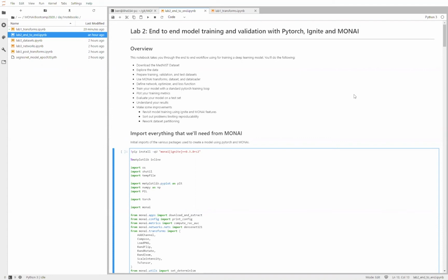Just to say a couple of things about this before you get going. We want you to play with this notebook and experiment with it. There's a few little things that we've thrown into it as activities, but we provide essentially all the code that you need to do anything that you want to do. So once you've worked through the basic network, have a look at the make some improvements sections.